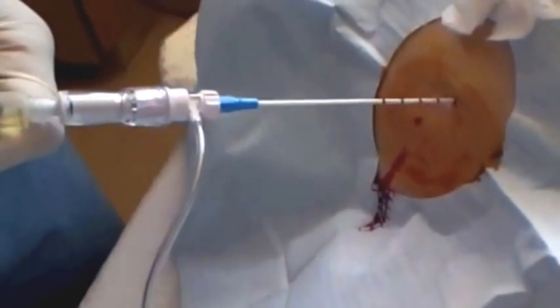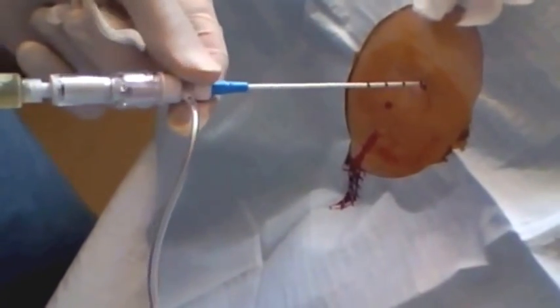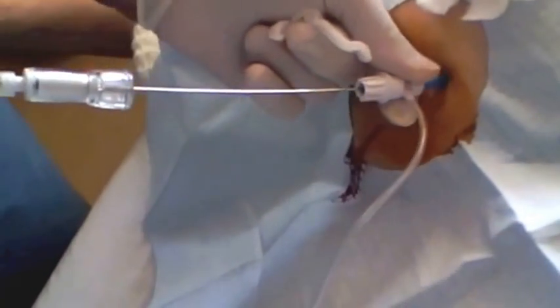You'll feel a little pop, and then you want to angle it up and then in, so you tunnel the track it goes in through. A little bit of pressure and you'll see the patient jump a little when it enters the peritoneal cavity. At that point, slide the catheter off of the trocar — don't pull the trocar out, because if you do the catheter may be outside the peritoneal cavity. Once you've slid it in, you can remove the trocar from the catheter itself.